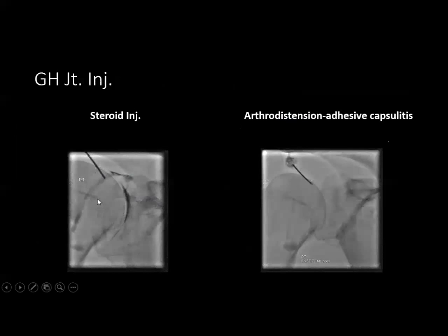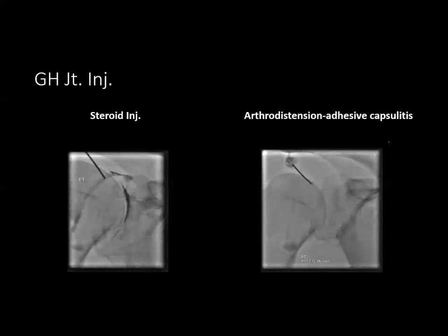Another example: injection of the glenohumeral joint — the shoulder joint. This is a fluoroscopic image showing contrast tracking into the glenohumeral joint, confirming we are in the joint, after which steroid and local anesthetic are injected. There is a modification called arthrodistension, a special procedure done in patients with adhesive capsulitis.